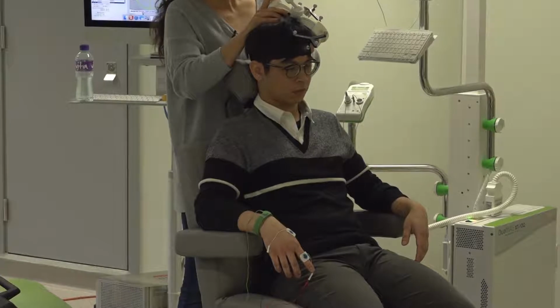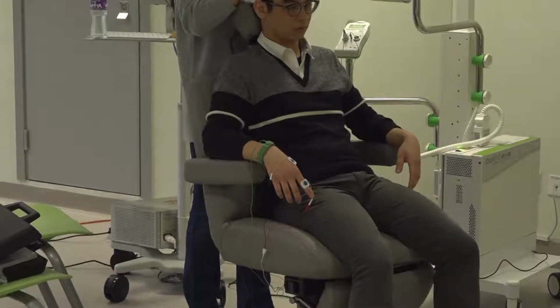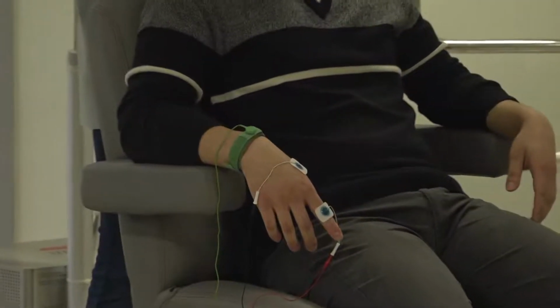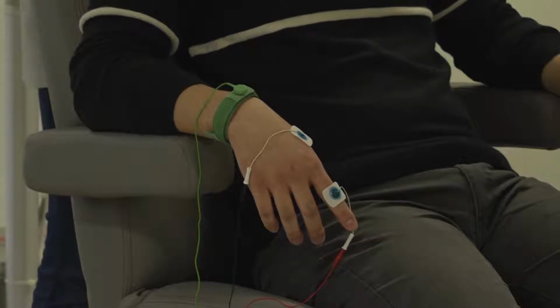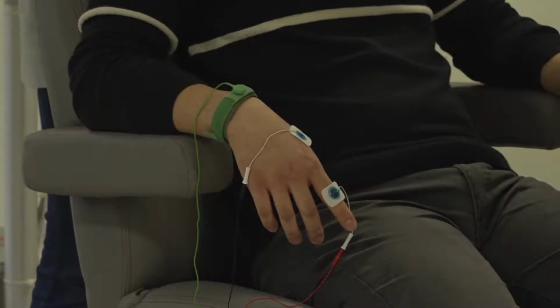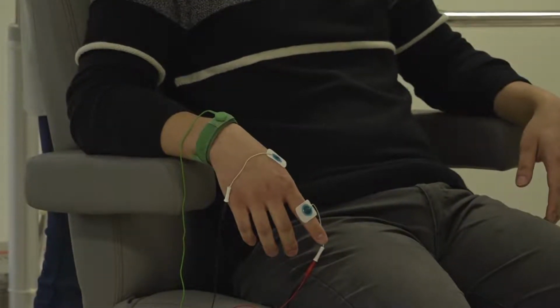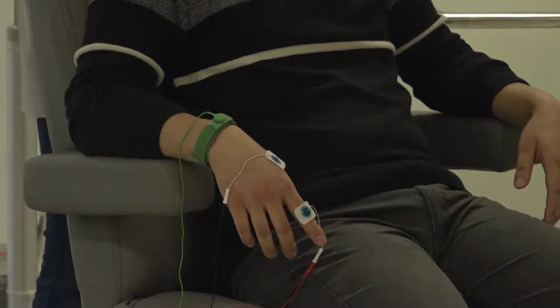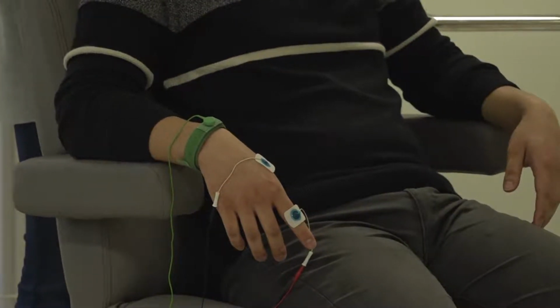Okay, now. So I'm moving around to see if I can find a better position.